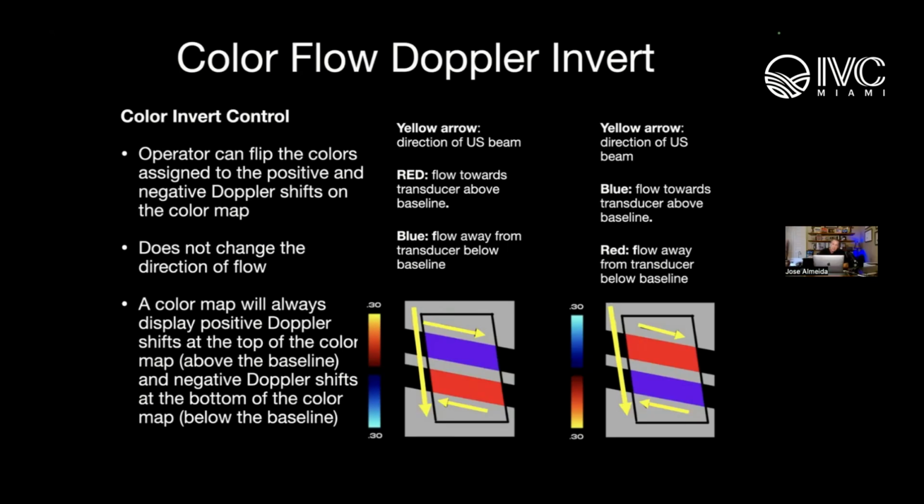Yeah, so when the reader, which is not the person doing this often, a radiologist or whoever's interpreting the study, is generating the report, in their mind, they want to see the image set up where the artery would be red, the vein would be blue, and a refluxing vein would be red away from the probe, just out of convention. Is that correct?